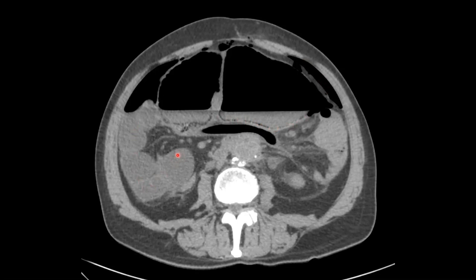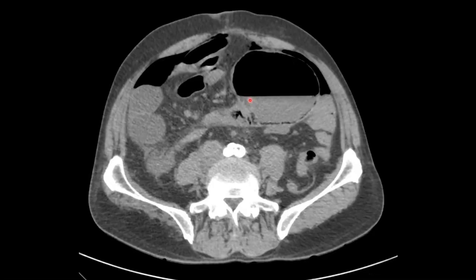There's all that dilated fluid-filled bowel. We see some areas of mesenteric stranding, and then here's the beginning of that twisting of the mesentery, which is the point of obstruction for the cecal volvulus.